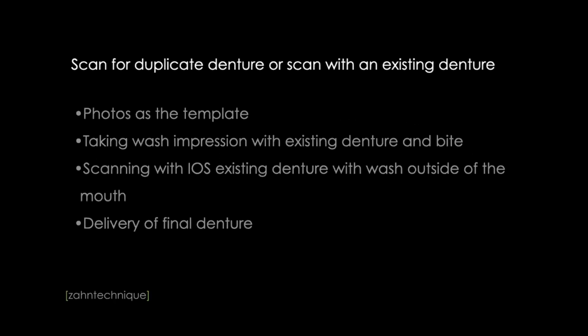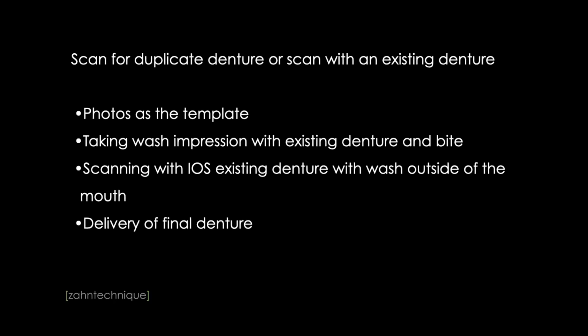Now we do a lot of duplicates. Sometimes we even do a finished case and we then already do the duplicate as a spare, right? Which is really cool. I think that's the biggest strength of duplicate dentures, right? So again, for something like this, we need photos as the template. We'll show you in a second.